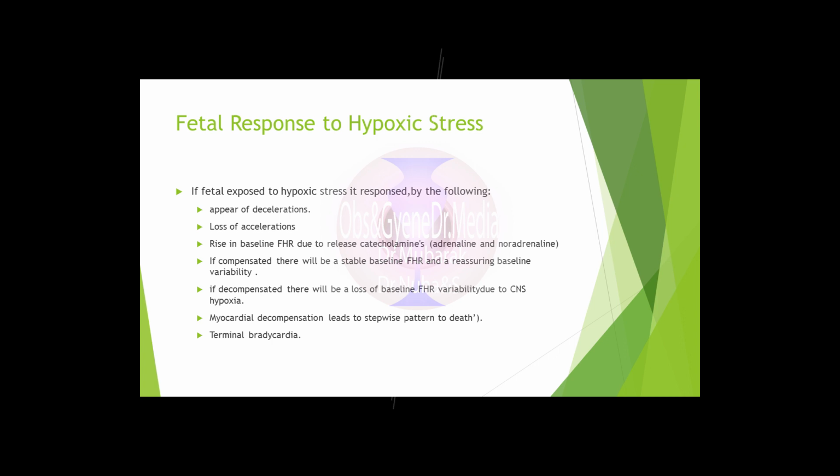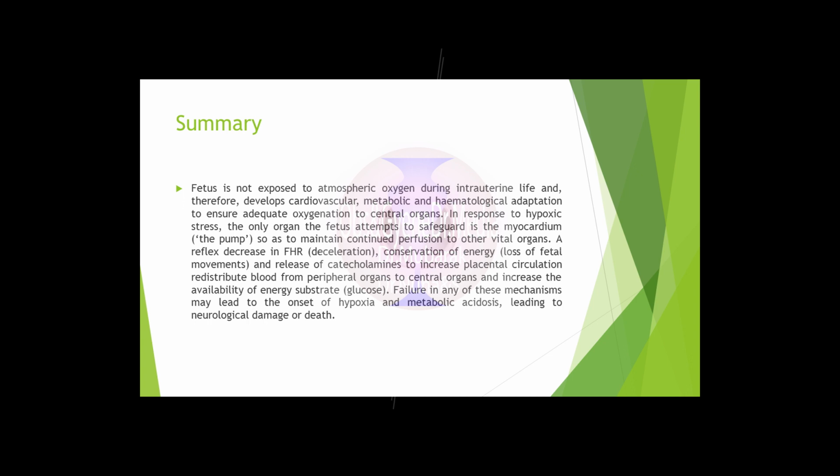This is followed by the onset of decompensation in the central nervous system, leading to a loss of baseline fetal heart rate variability, followed by the onset of myocardial hypoxia and acidosis characterized by unstable baseline and progressive reduction of the heart rate, a stepwise pattern to death.